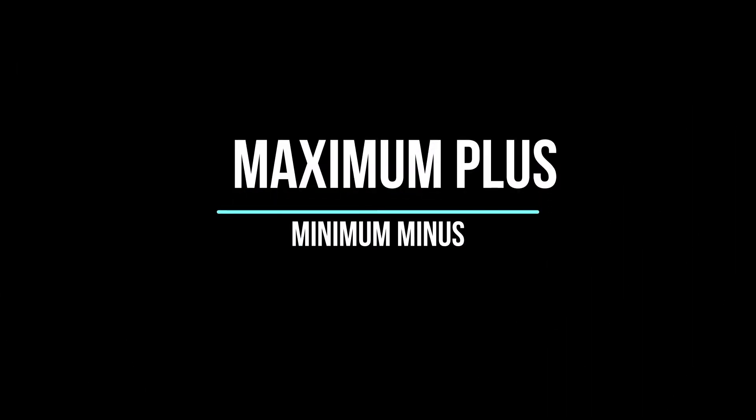If they get to the 6/6 line, add a plus and then a minus lens of a smaller denomination, asking if they can still read. Remember, the point is always to have the maximum plus and the least minus. If they have not reached the 6/6 mark, continue to add more plus then minus lenses until there is no more improvement with either lens. At this point, you may have reached the end point, but you still need to perform the duochrome test to know whether you have overcorrected or undercorrected.